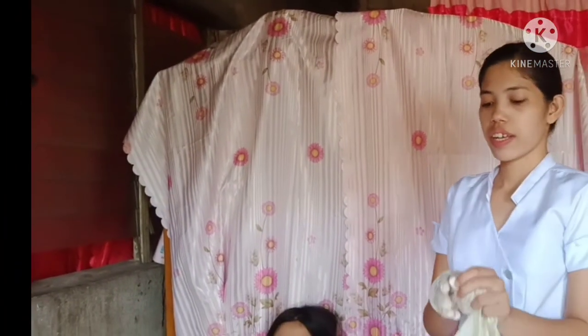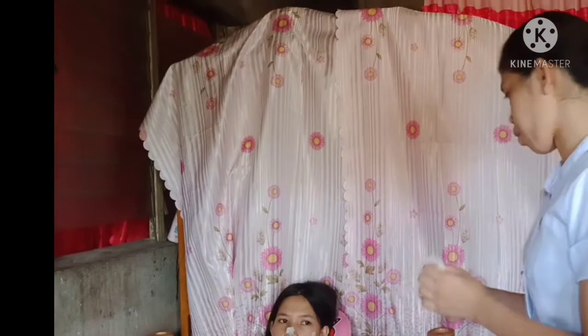And after that, we have to observe the return of normal laboratory values since it indicates an improved nutritional status. After that, we have to remove gloves and wash our hands since hand hygiene deters the spread of microorganisms.